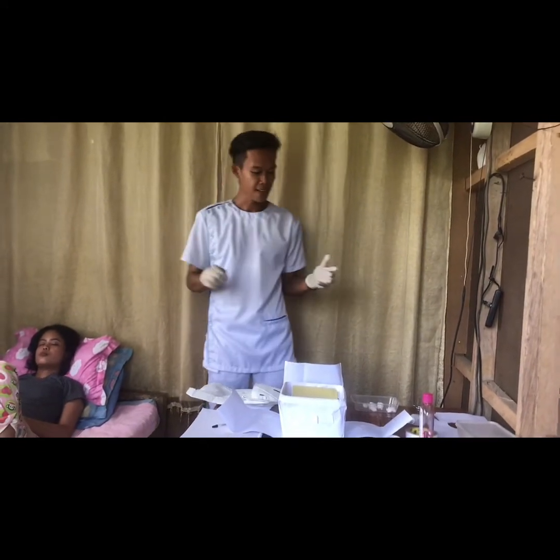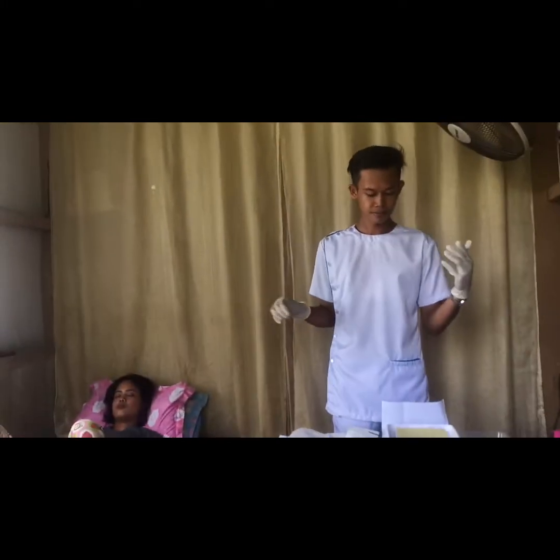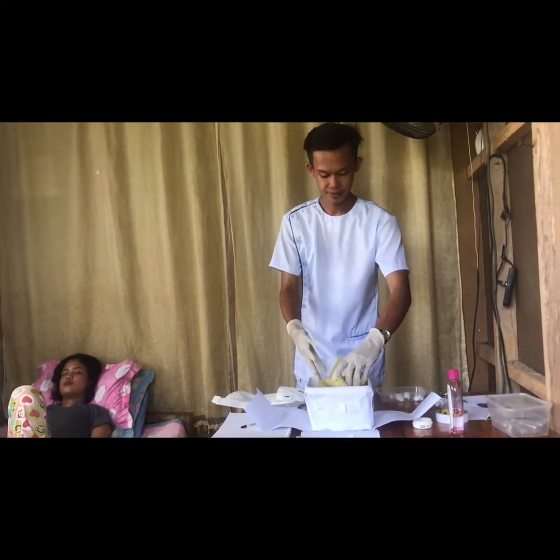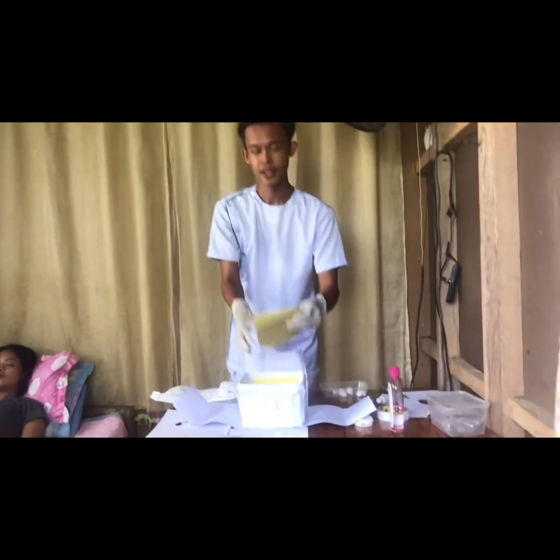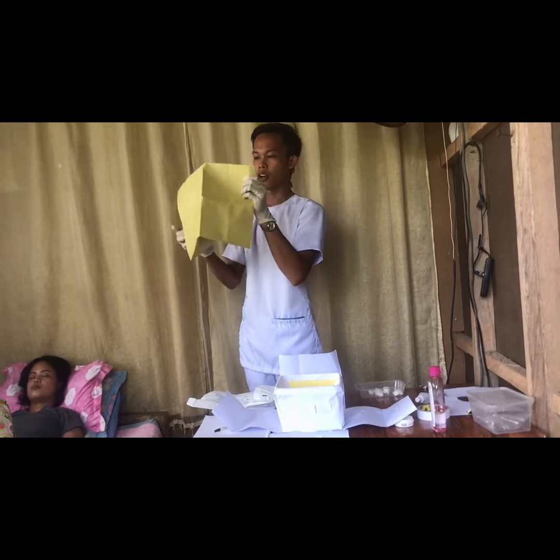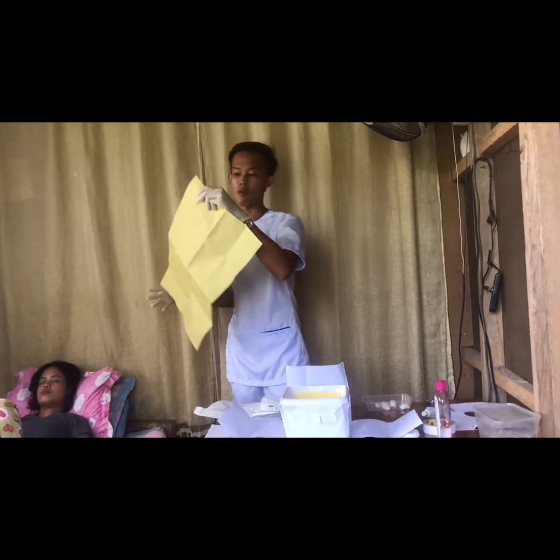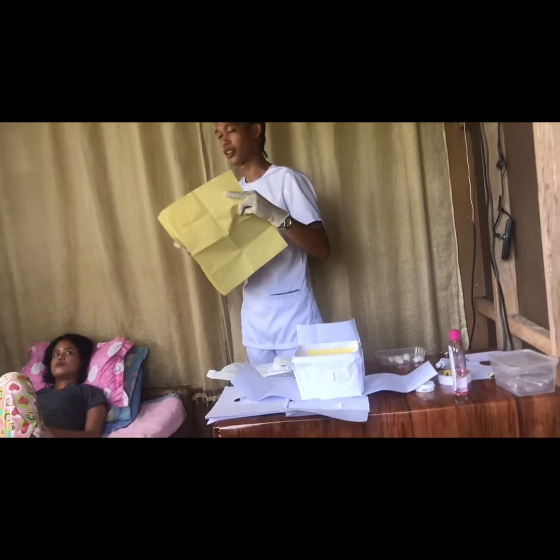So for this time, I'm going now to hold the equipment inside. Okay, the equipment inside, we have this one. This is the fenestrated drape. Okay, so it has two parts, which is the shiny and the not shiny. The not shiny absorbs water, and then after that we're going to place it underneath the patient.